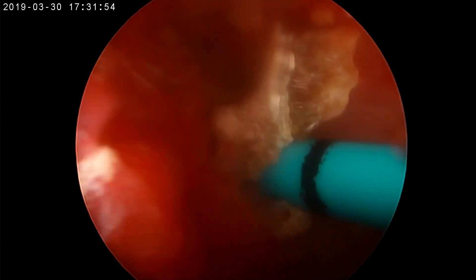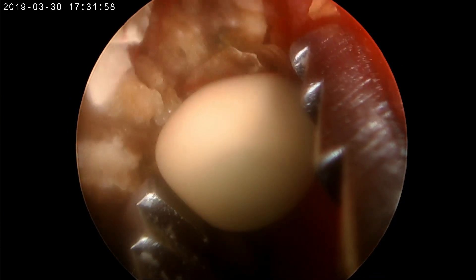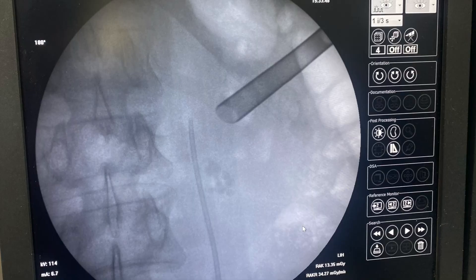After that, the stone was broken using a pneumatic lithotripter. You can see the secondary stones also being found after clearing the major bulk of the pelvic stone, and these stones are removed one by one.